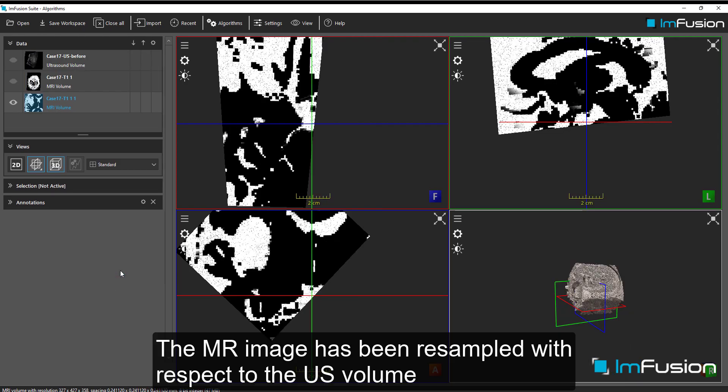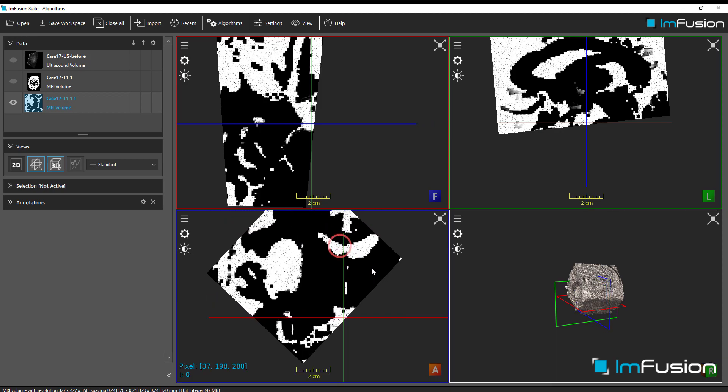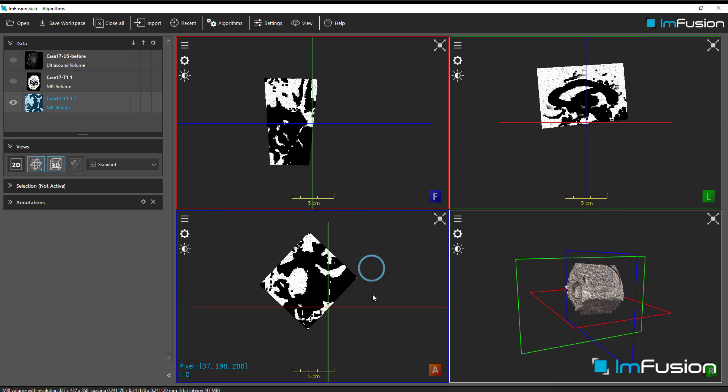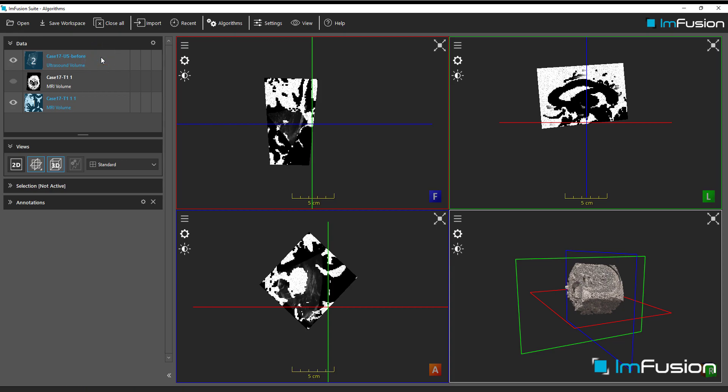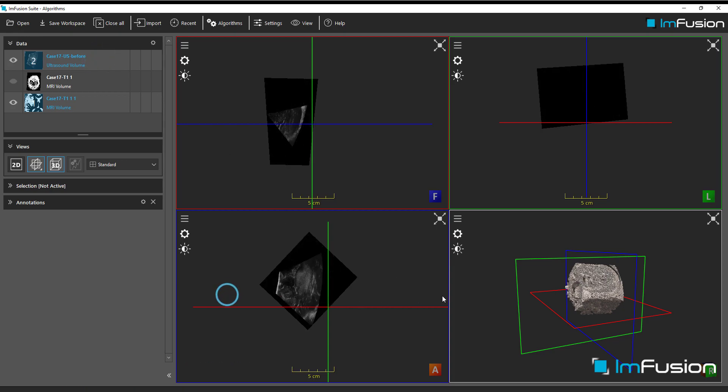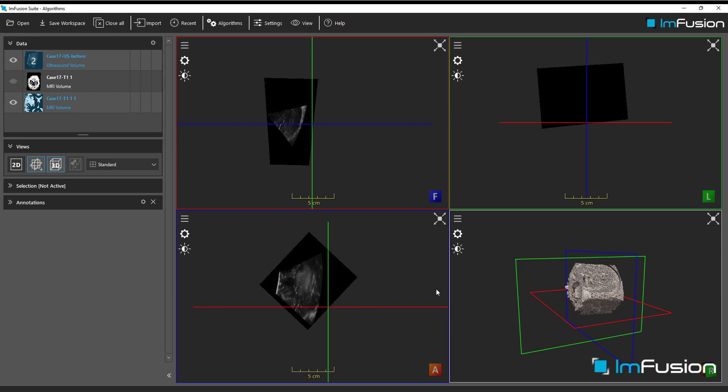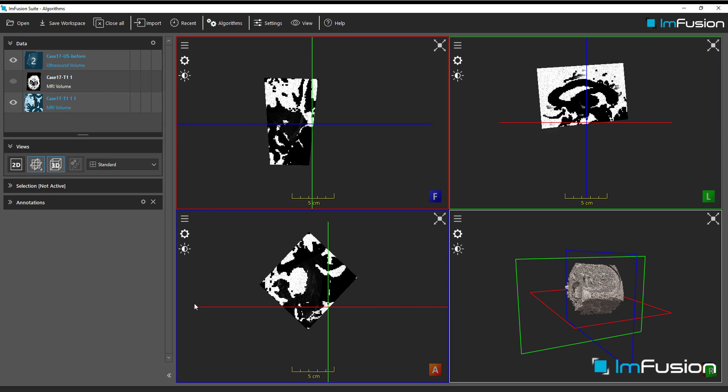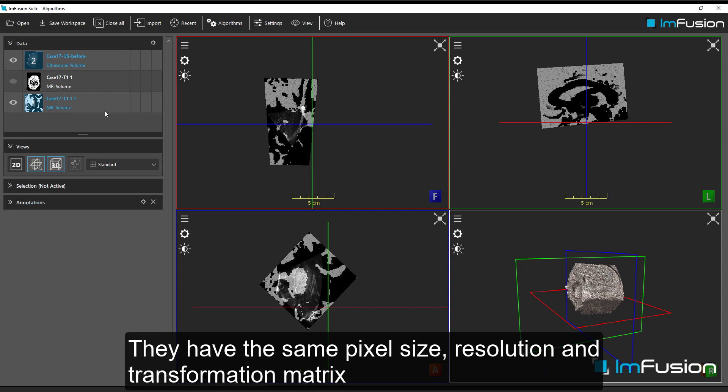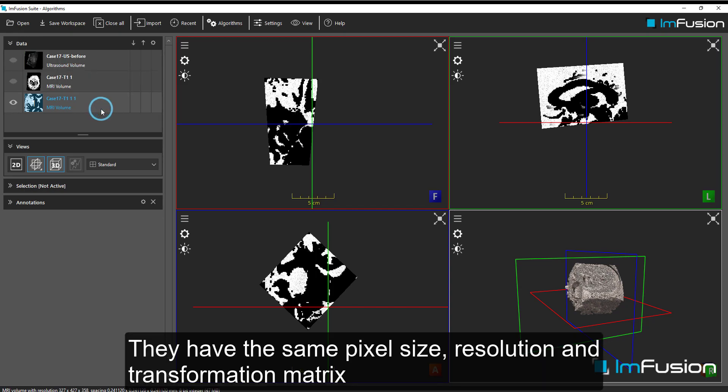The MR image has been resampled with respect to the ultrasound volume. They have the same pixel size, resolution and transformation matrix.